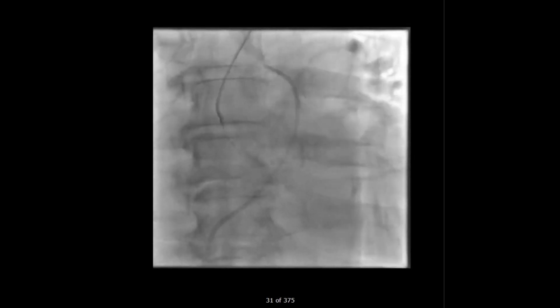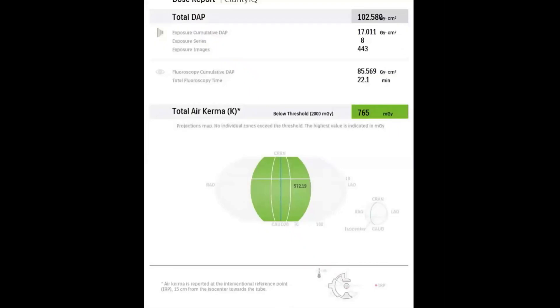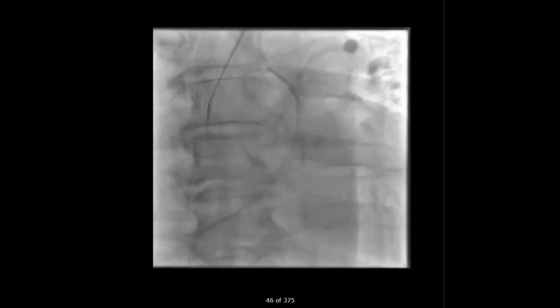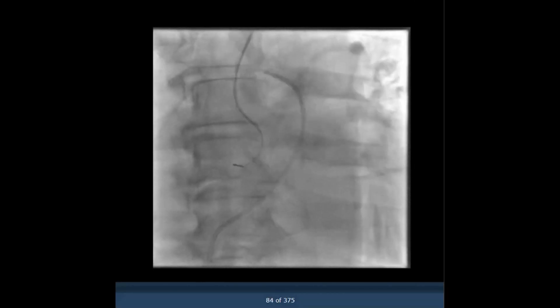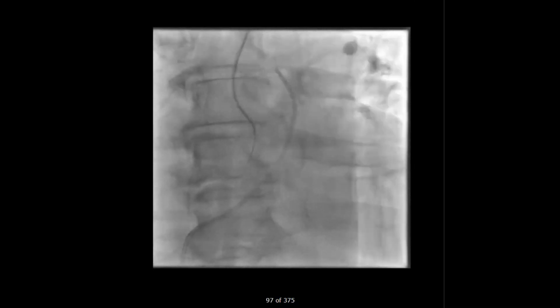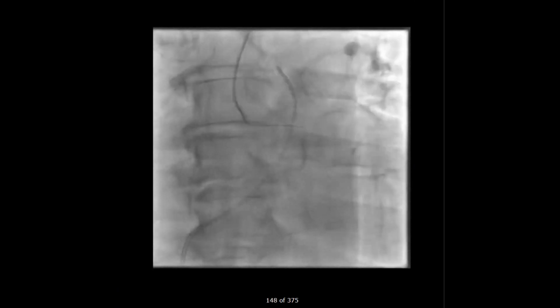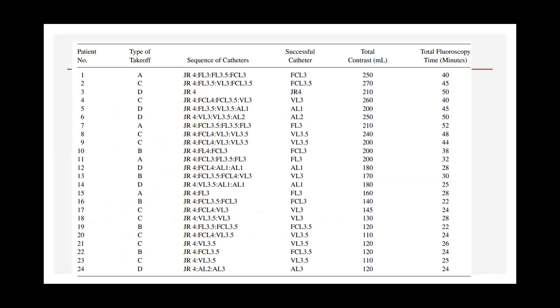I'm trying to cross the valve, and the valve was crossed — that's pretty much it. These are a series of different cases from Mount Sinai where patients had different types of takeoffs: A, C, D, and so on.